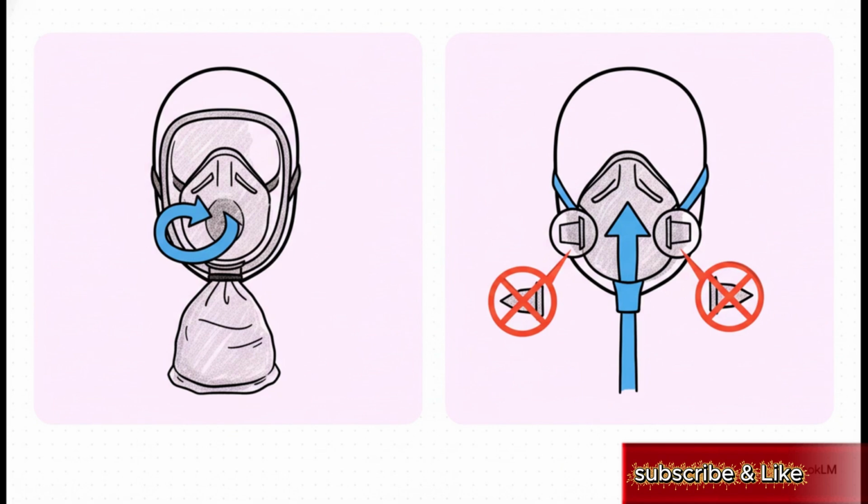All right, now it's time to bring out the real big guns, the rebreather masks. They might look super similar, but trust me, there is a crucial difference between them. A partial rebreather actually lets a tiny bit of exhaled air back into the reservoir bag. But the non-rebreather, or the NRB, has these clever little flutter valves that act like one-way doors. They let exhaled air out, but they slam shut to keep any room air from getting in. This simple little feature means the NRB can deliver the highest possible concentration of oxygen.